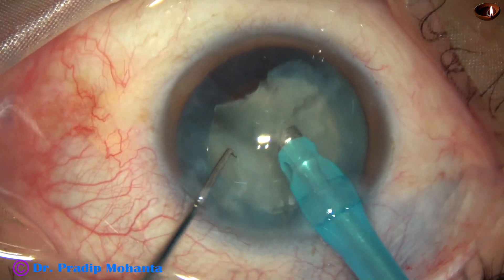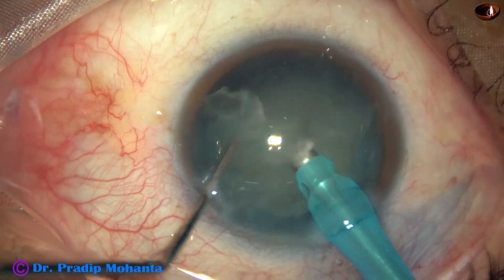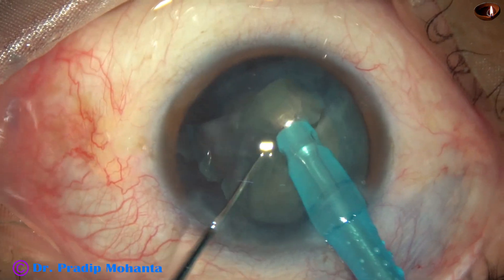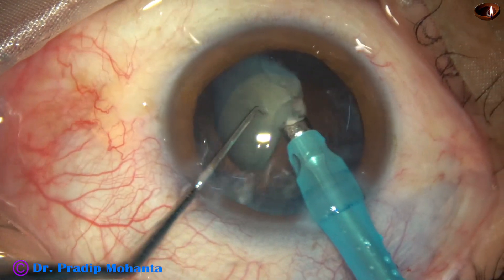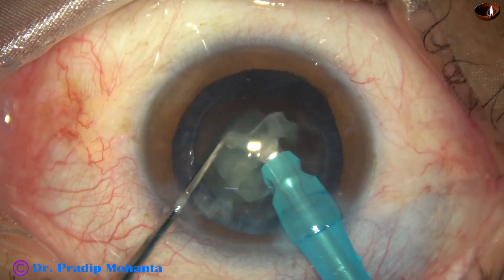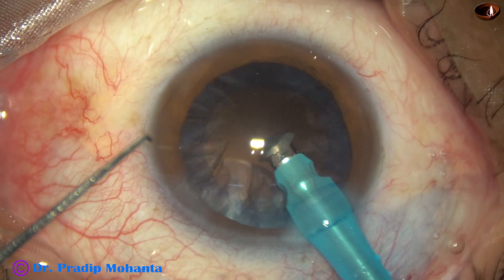Ultrasonic energy used in this case is 65%. Flow rate is 45 ml per minute. Vacuum is 450 mmHg. This is the last portion of the nucleus, emulsified at lower parameters. And it is done.